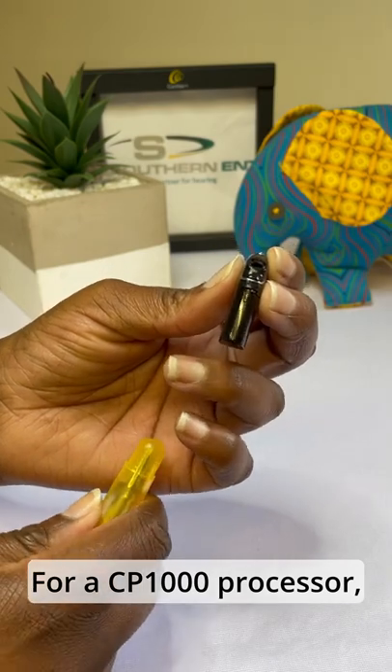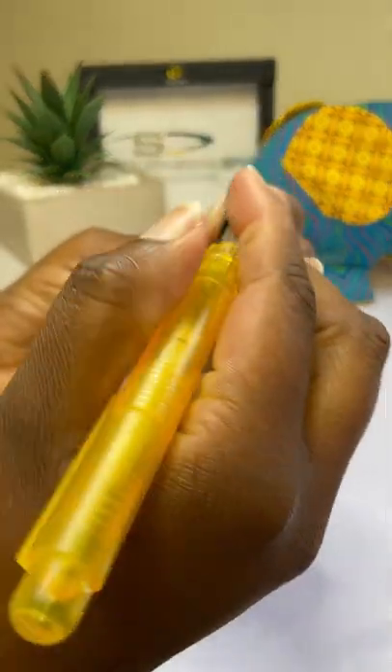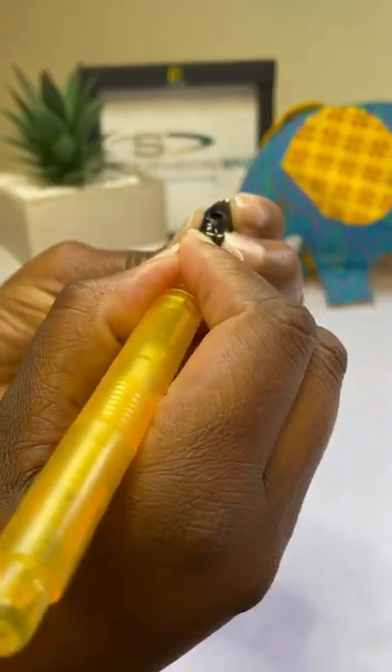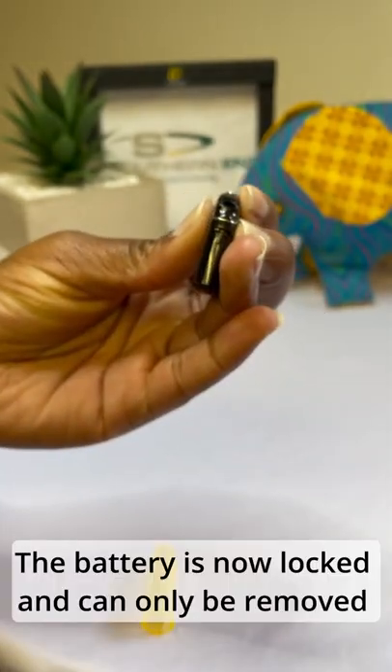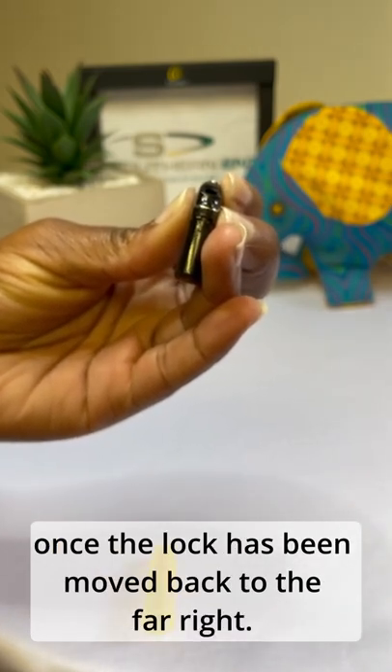For a CP1000 processor, use a locking tool to move the lock to the far left. The battery is now locked and can only be removed once the lock has been moved back to the far right.